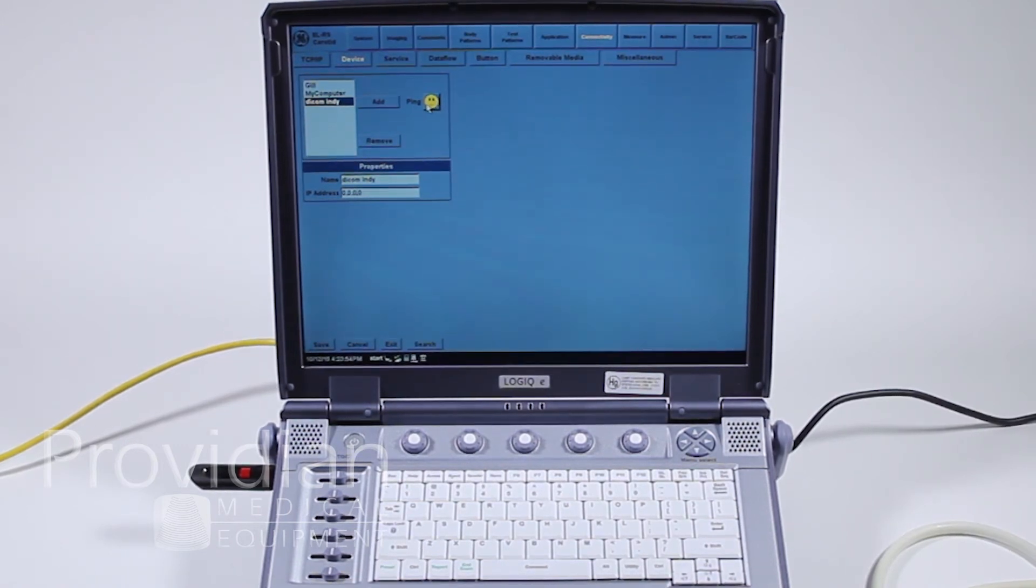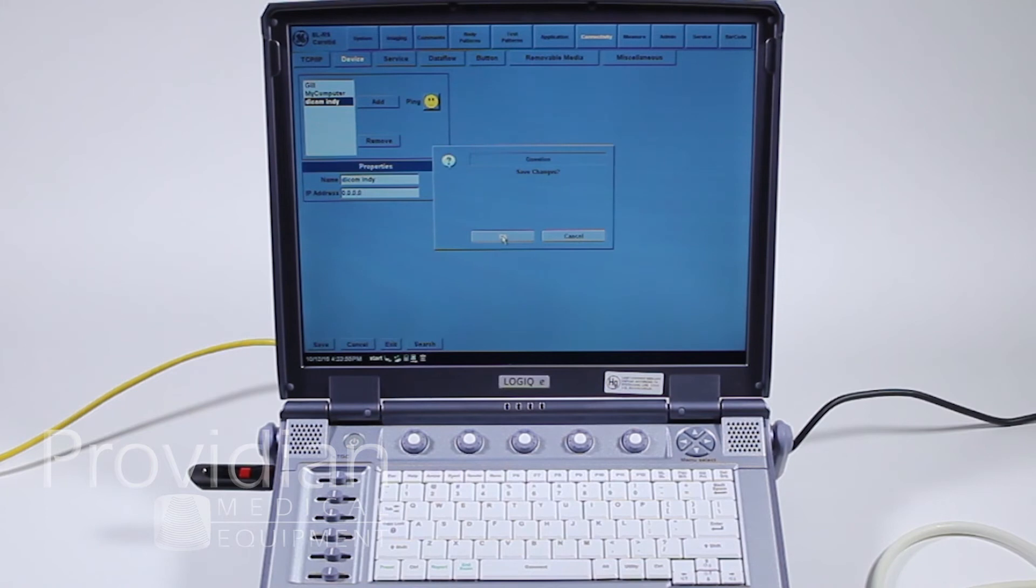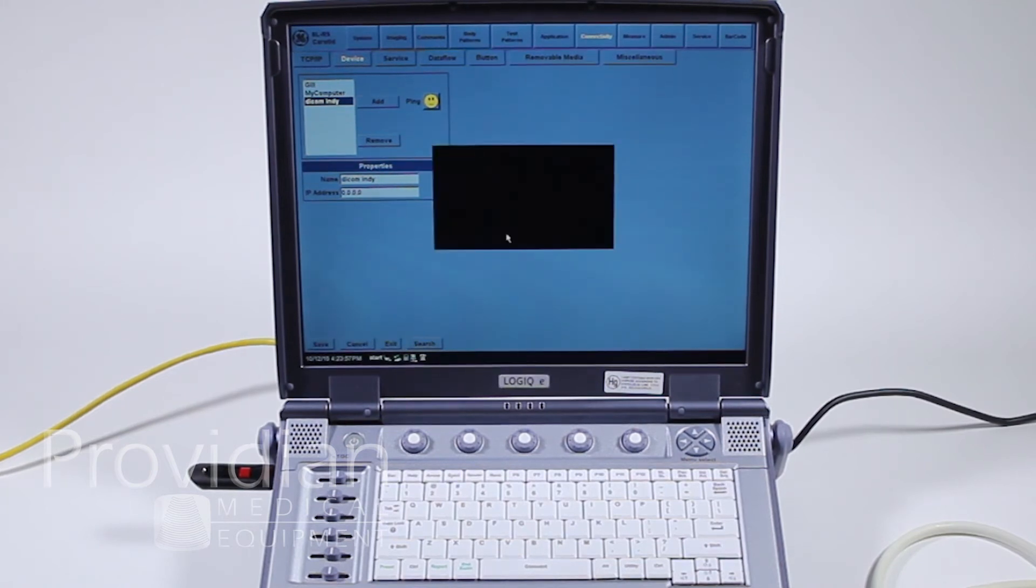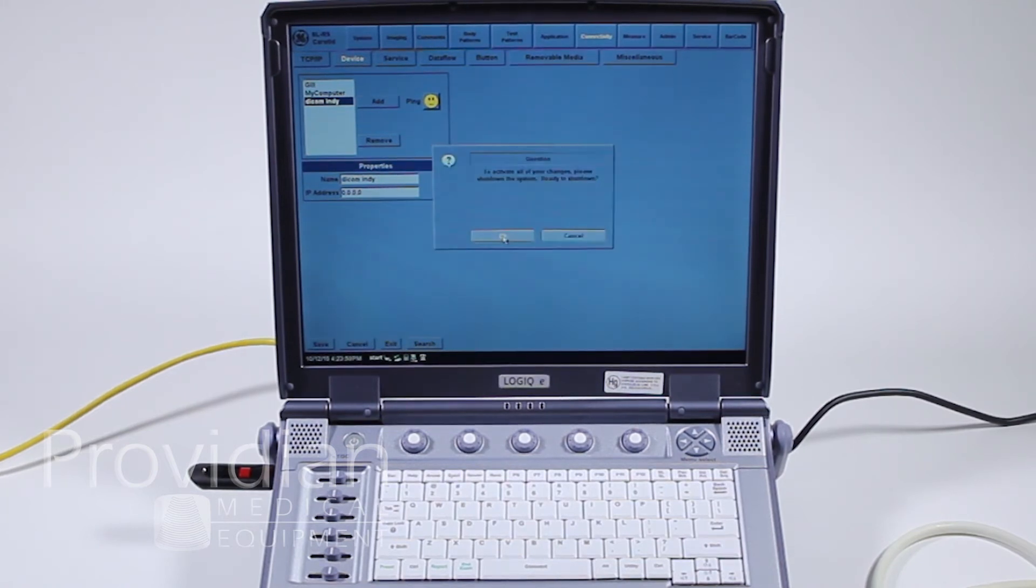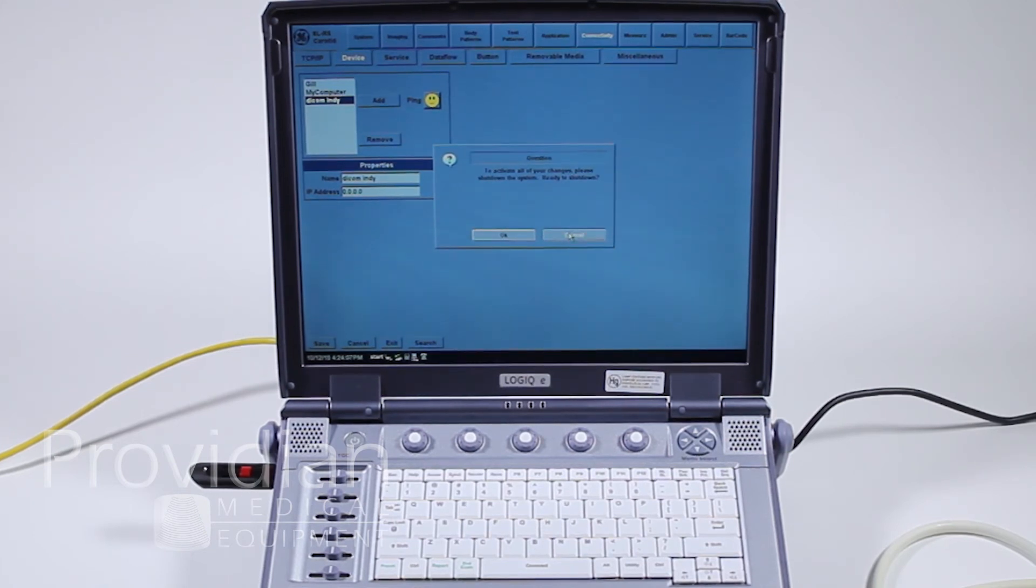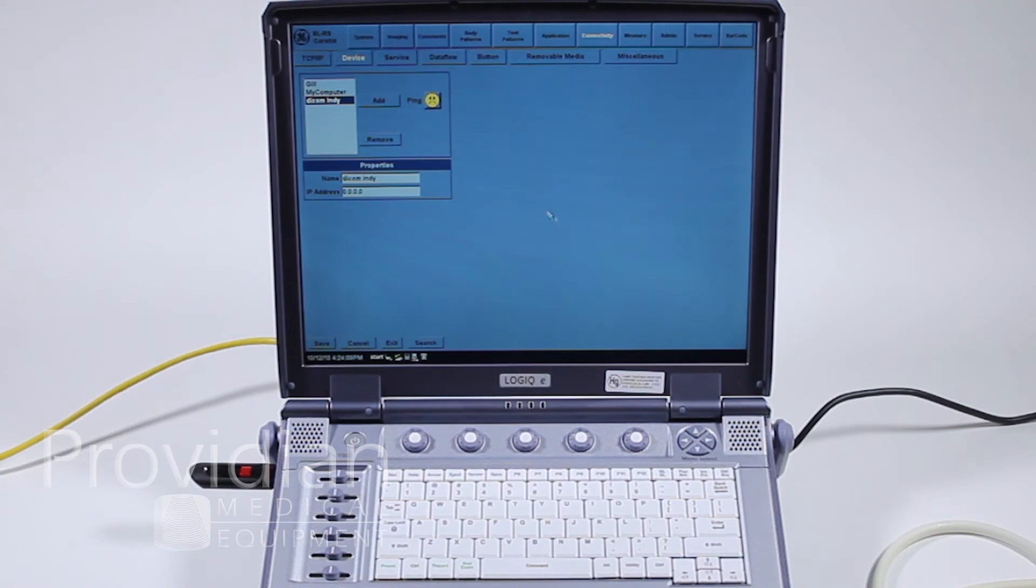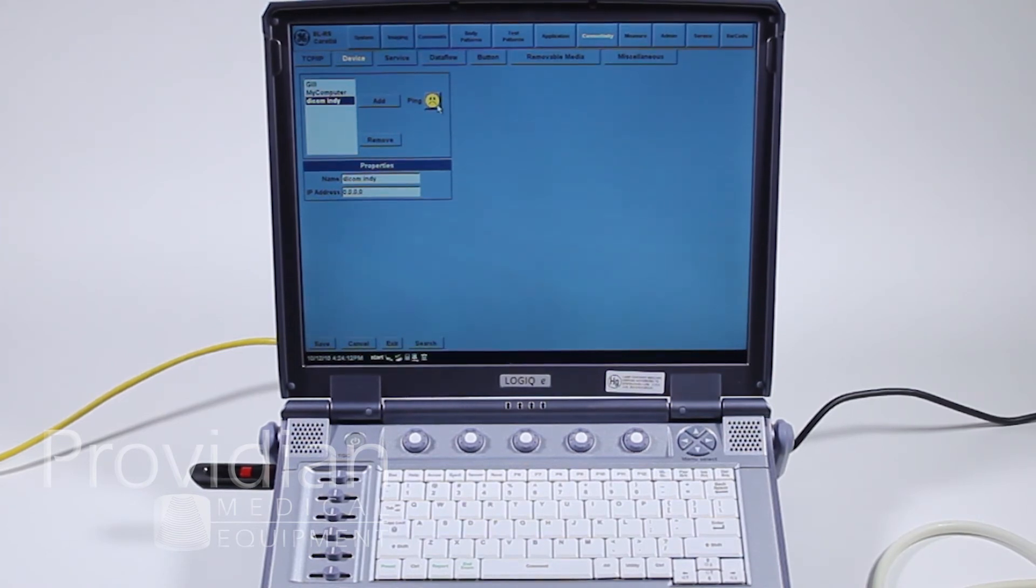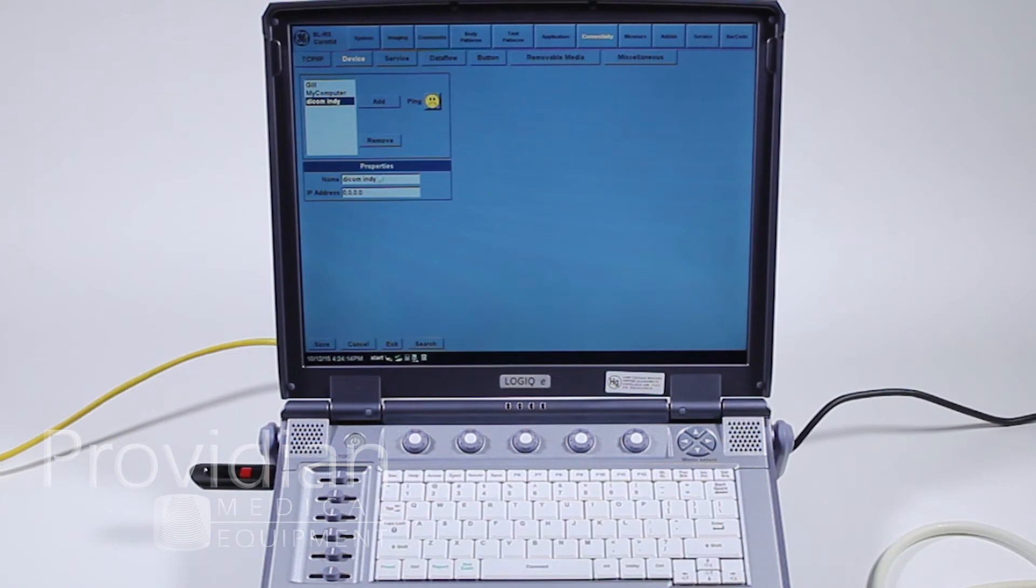They would give you an IP address that you would plug in there. Since I don't have an IP address, I can check this device by clicking ping. First, it says, do I want to save changes? I want to say yes. Unfortunately, it wants me to shut down the software in order to save those changes, but don't worry, I can do it without doing that. I pinged it, and it's got a frown face. It's because I don't have an IP address. It's not going anywhere.